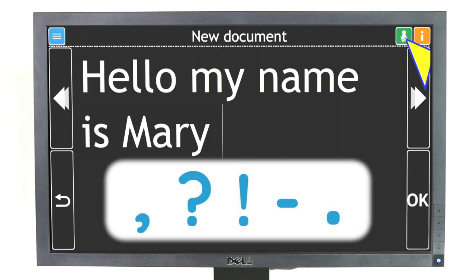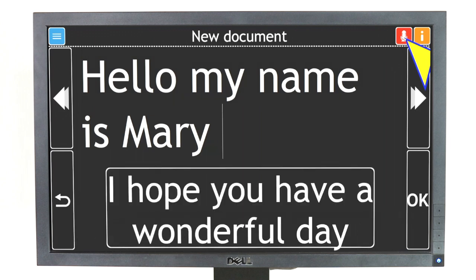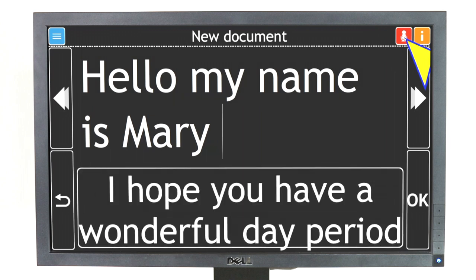You can add commas, question marks, and periods at the end of your sentence by announcing the symbol at the end of your speech — for example: "I hope you have a wonderful day, period."